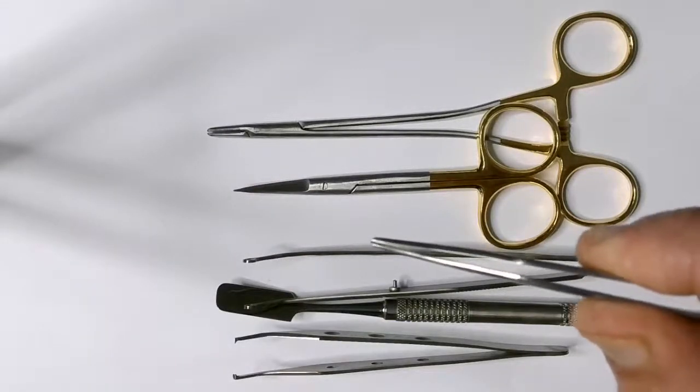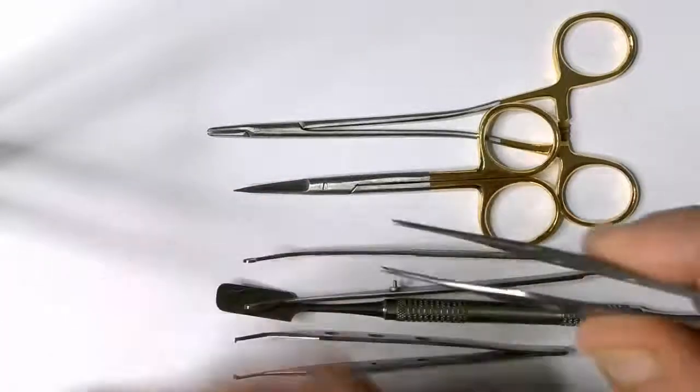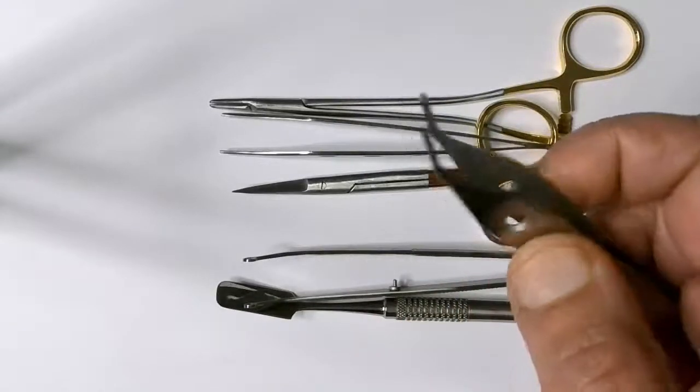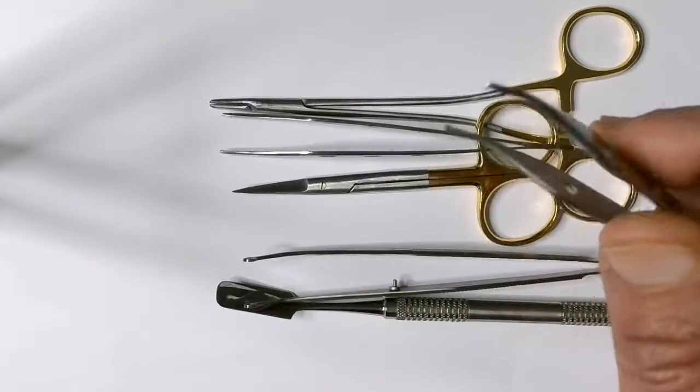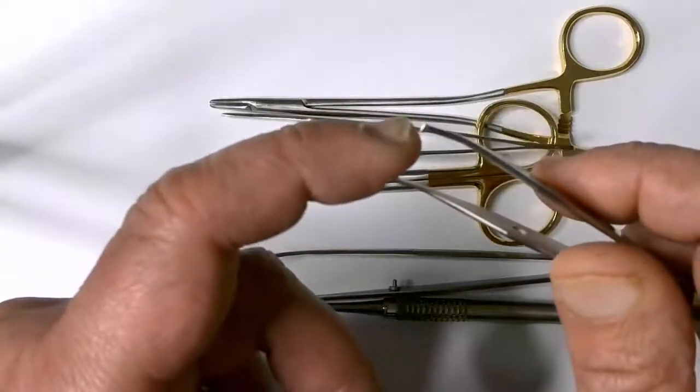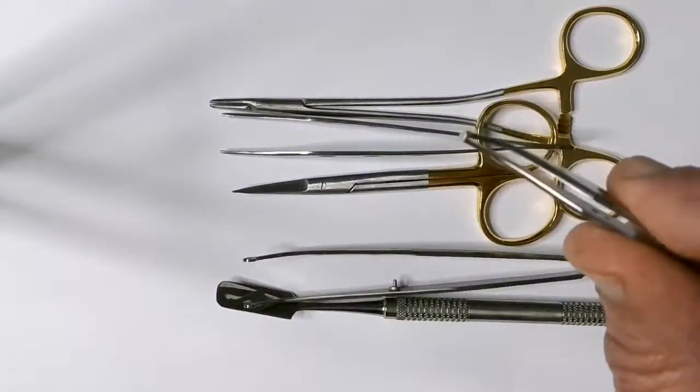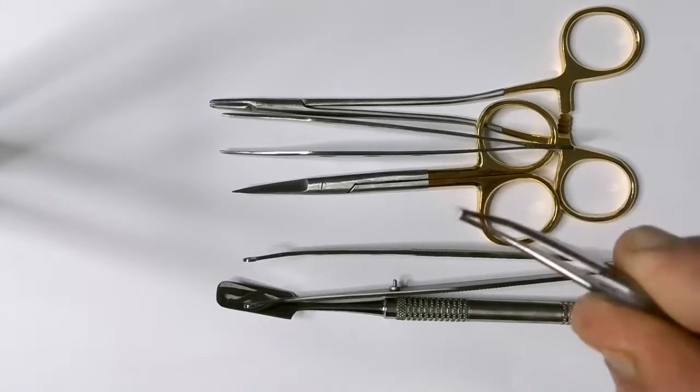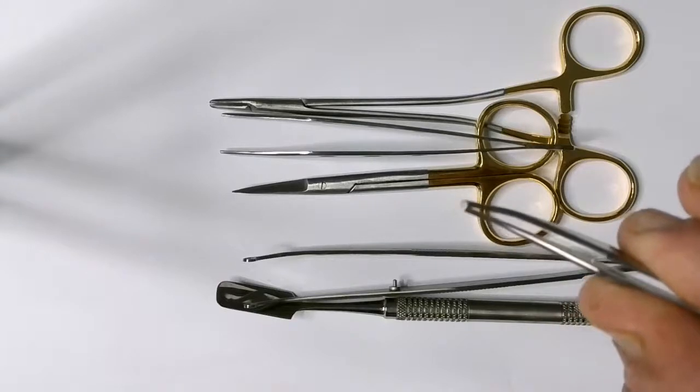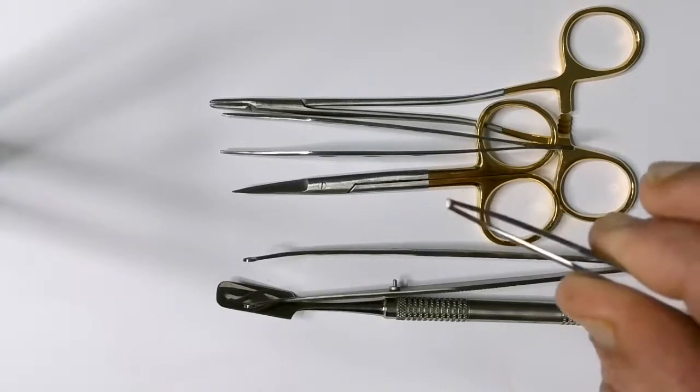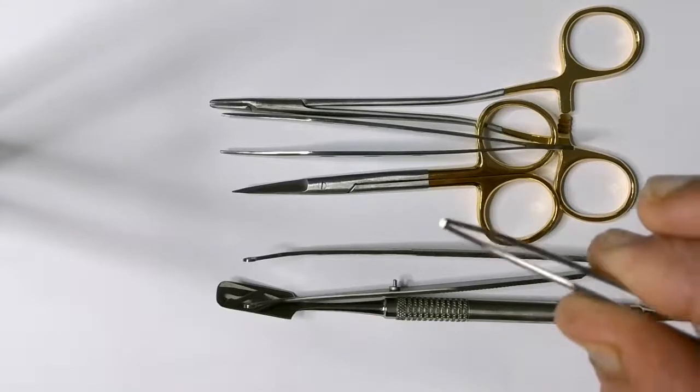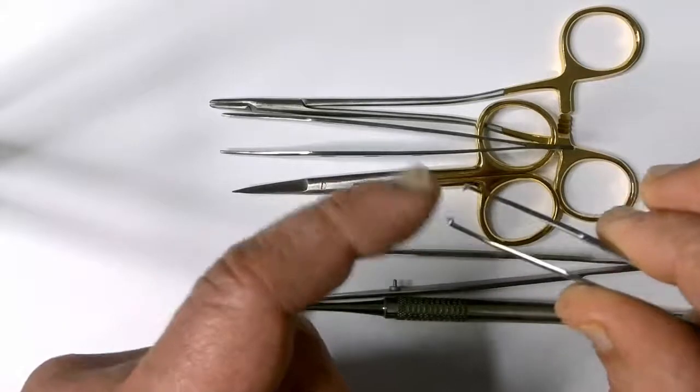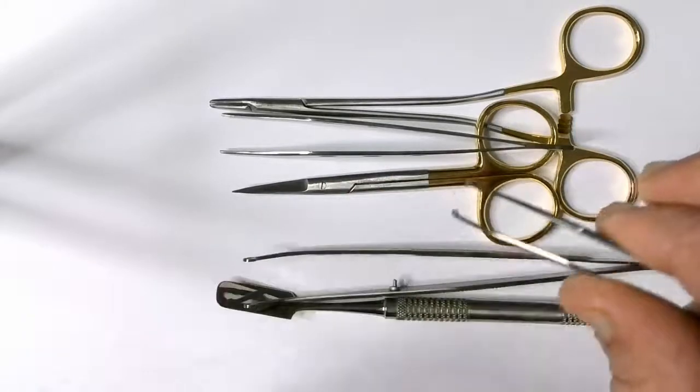The toothed forceps, as you can see, it's got a tooth here and a groove there. So when you hold the tissue, the tooth and the groove meet and they lock the tissue in place. I only use this if I have nice and thick keratinized mucosa. I wouldn't use this in thin tissue because as I'm pulling it, it could rip it or cause a tear with this tooth.